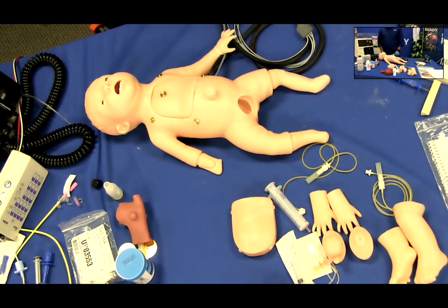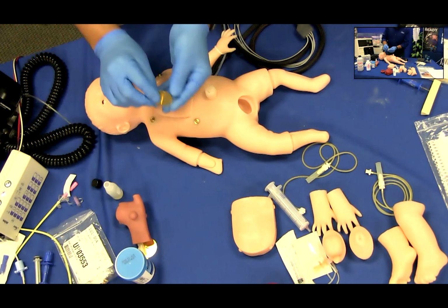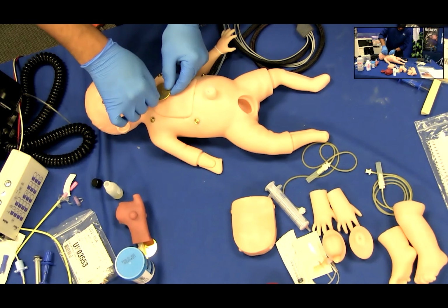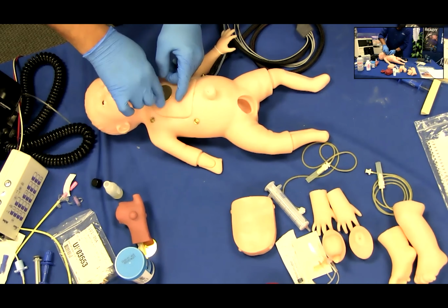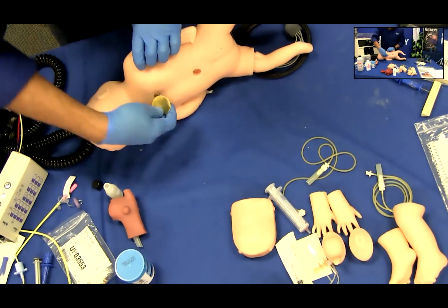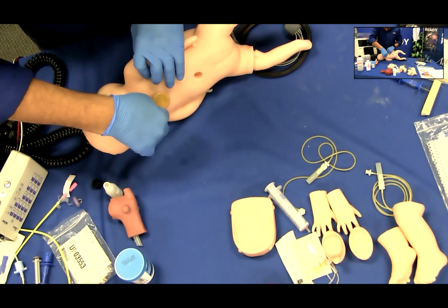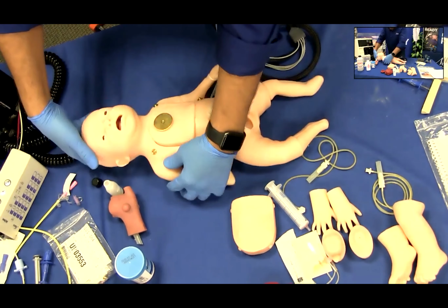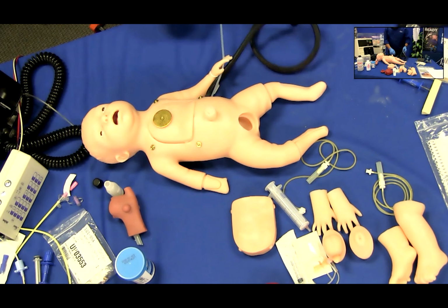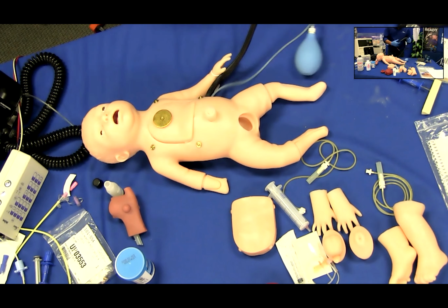Next, screw the round defibrillation adapter posts into the defibrillation chest skin and into the post site on the posterior of the simulator. Now, attach the defibrillation cables coming from the left side of the mannequin, labeled sternum and apex, to the interactive ECG simulator.